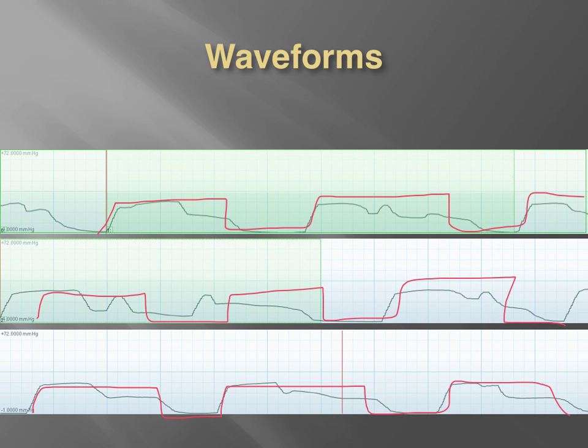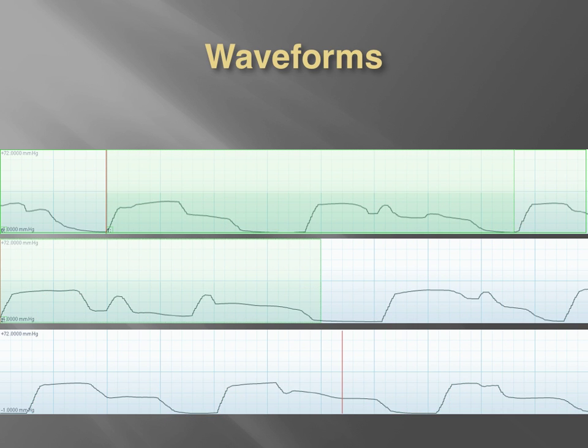So all this really was for this patient was that this patient was talking. Okay, so we can easily have what we consider artifact, just the same as if you have a patient on a 12 lead and they're talking or shaking or moving around. We're not going to get a good sample of what we're looking for. So in this case, yeah, maybe the patient didn't really need to be transported to the hospital, let alone have capnography. But it's also a great illustration of what you might see at one time or another.